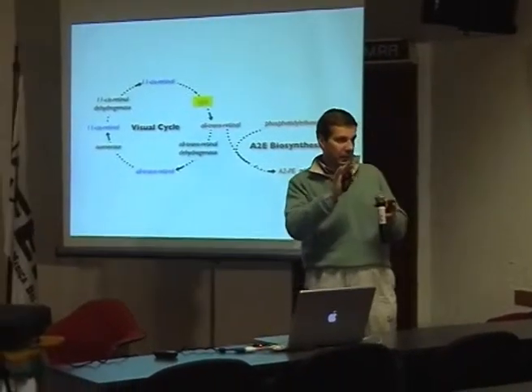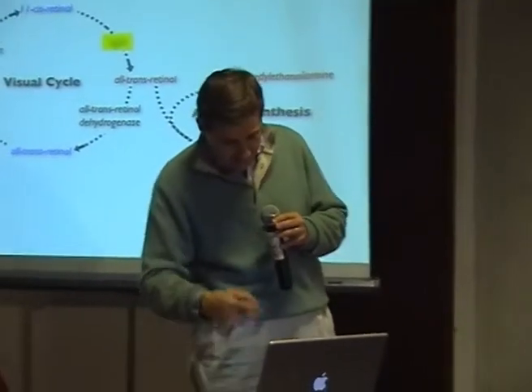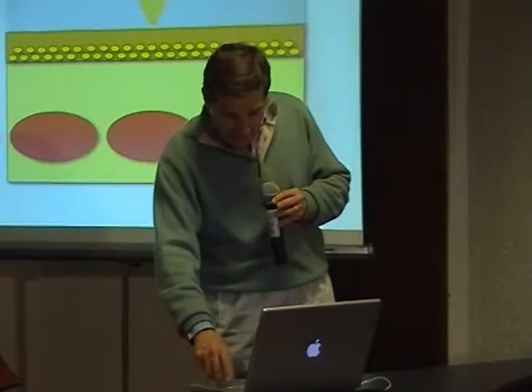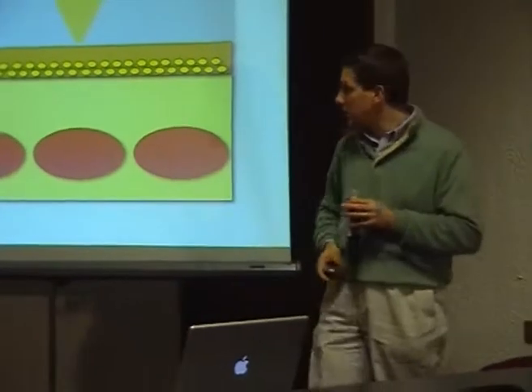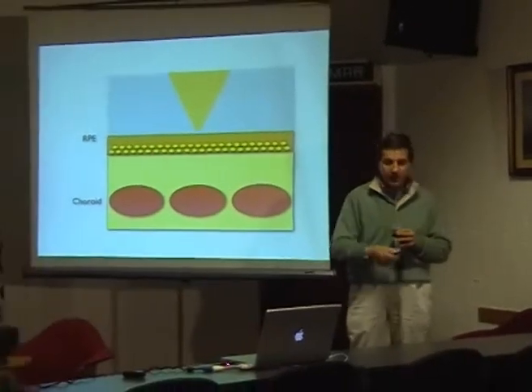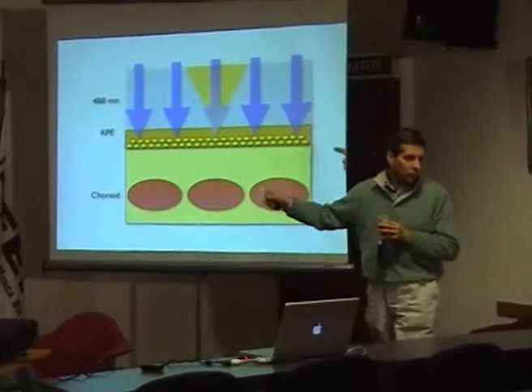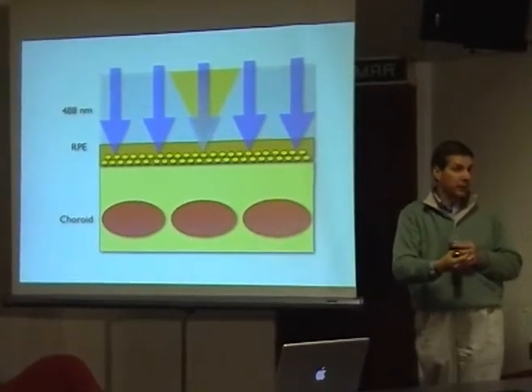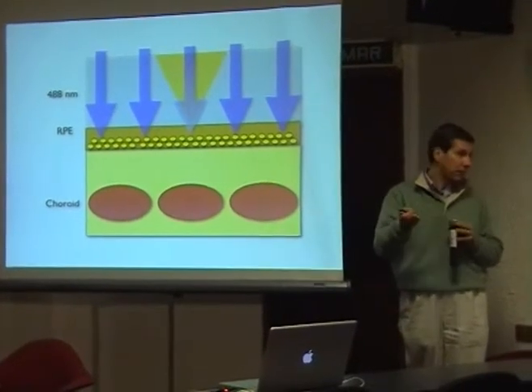This is a theory, and it's tried to be proven with these two trials that are running almost completely now. So we actually have an idea, taking an autofluorescent image, how the RPE cells are sick or not. Now, it's easy to get, because you use an excitation light, a 488 nanometer wavelength. That is the one that you use for fluorescein angiography, exactly the same.